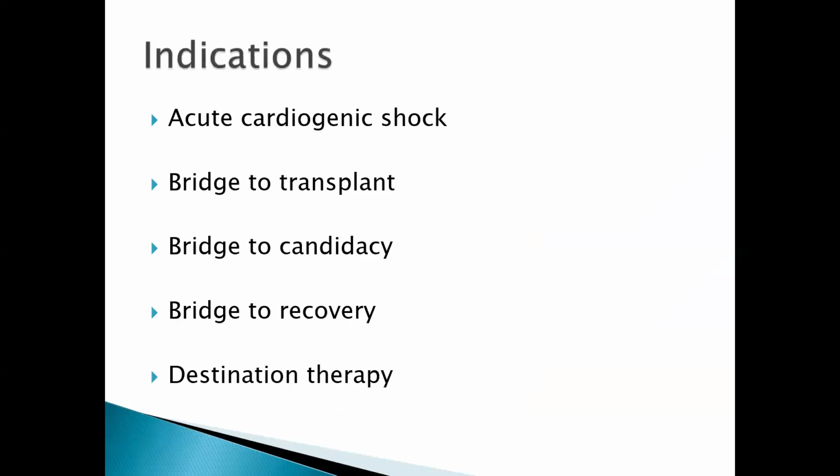So what are the indications for this ventricular assist device? The indications are grouped. The first is acute cardiogenic shock. If a patient has acute cardiogenic shock and the heart is not functioning well, the short-term pumps can be used at this point.